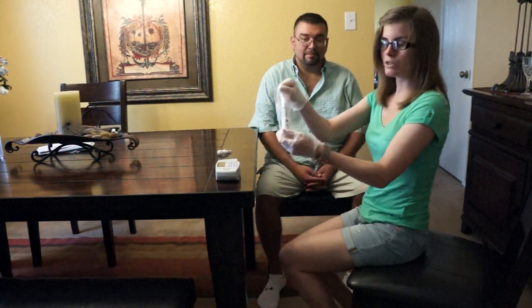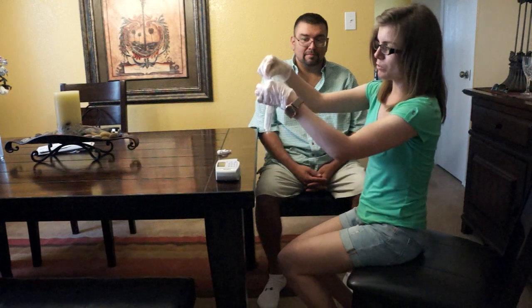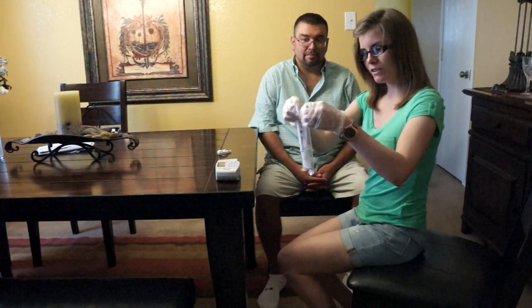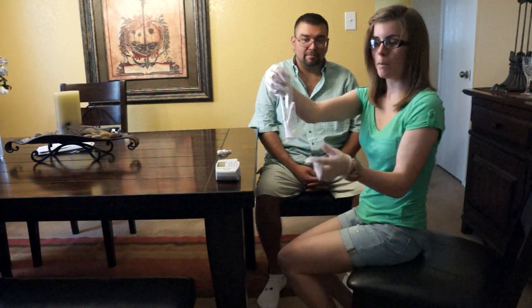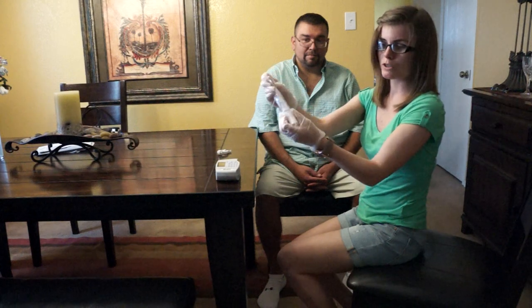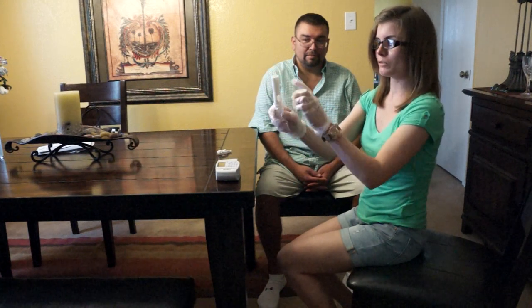Okay, then you're going to get your spirette. Now, the way these are set up is it has a perforated edge right here, and you're going to undo the perforated edge on the bottom of the spirette. Remember, this is their mouthpiece, so you don't want to touch this part. You want to make sure you open it from this part and pull it down, okay?